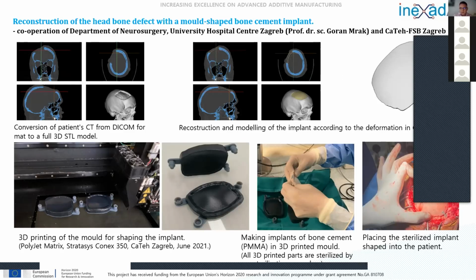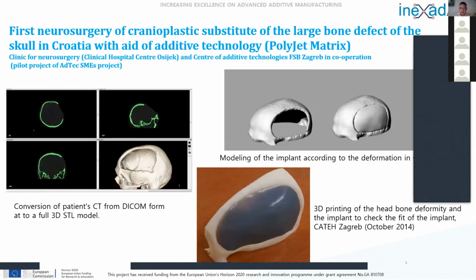as soon as you complete production of the implant, as soon as your two components are cured together. So this means that if you prepare an implant one day before, the patient will be short for these 20 or maybe 24 hours of releasing the antibiotics. So this is the reason why the implant is produced almost immediately before being built into the patient, so that the patient receives the maximum dosage of the antibiotics.